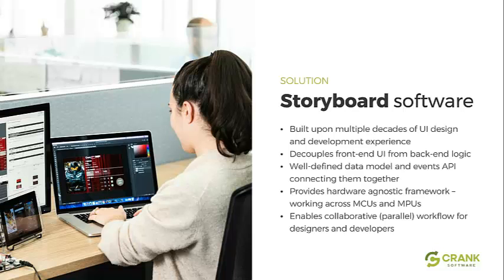because we need to make sure that we can satisfy both the design team and an engineering team, just because the makeup of the engineering team and design teams have changed. It used to be, when a lot of these devices came out, the engineering team made all the decisions. The look was very much like an old Windows dialog box, and then it just went forward. Well, today everybody wants to make sure they have their branding, their look, their feel. You may not think animations are important in a medical UI, but they are very important at a small level, maybe not large animations, but just user feedback animations that make it easier to use.